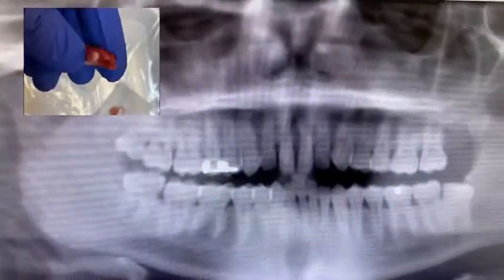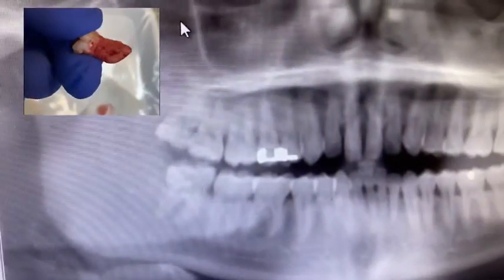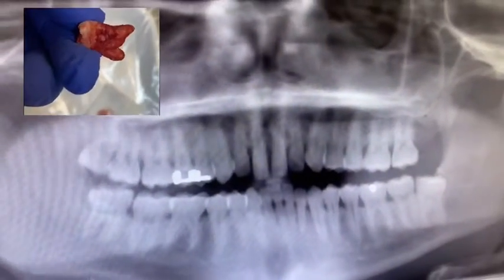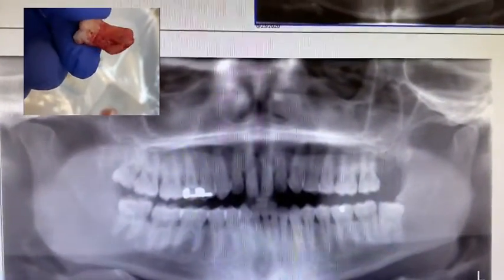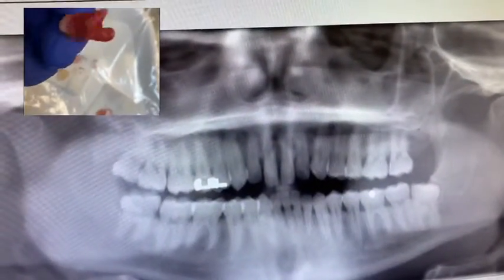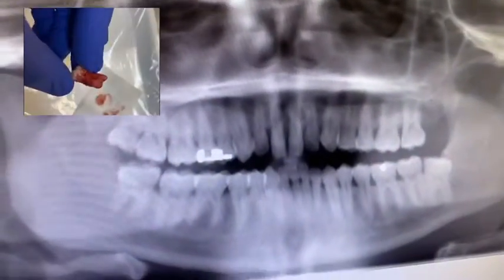I fractured a couple of times with this because the patient's mouth wasn't that big, so I had a hard time seeing everything clearly. But at least this is a completely erupted tooth, so it wasn't that bad. But anyway, it's actually funny. It took longer to get tooth number 1 out than number 32 today. That's because of the visibility and the 3 roots that you see, the curved root there.